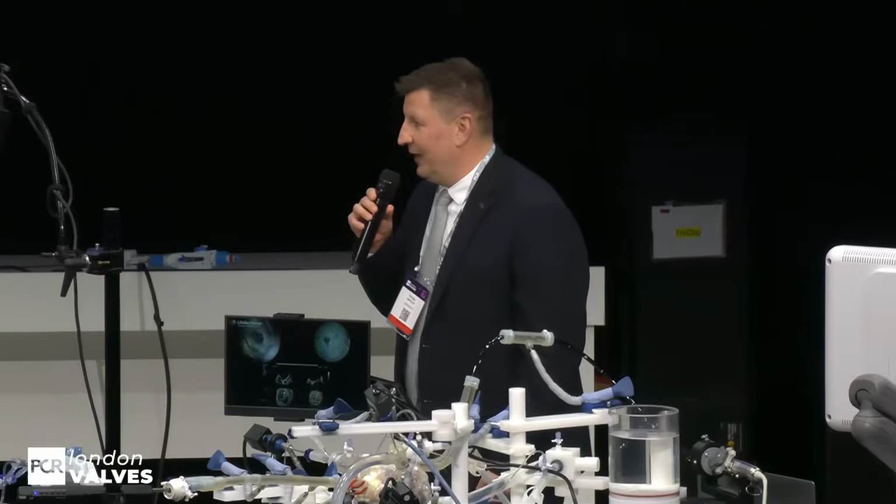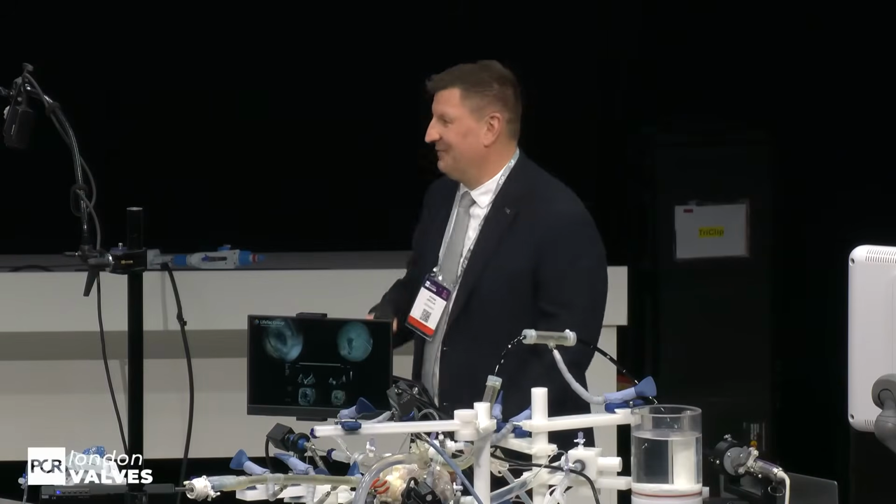Maybe while they change, just one quick question. Do you always do a pacemaker interrogation after these interventions, before and after, to check for pacemaker function? Normally not. We do actually in each patient that we treat with leads. But so far, no problem. So I think you're right in not doing it.